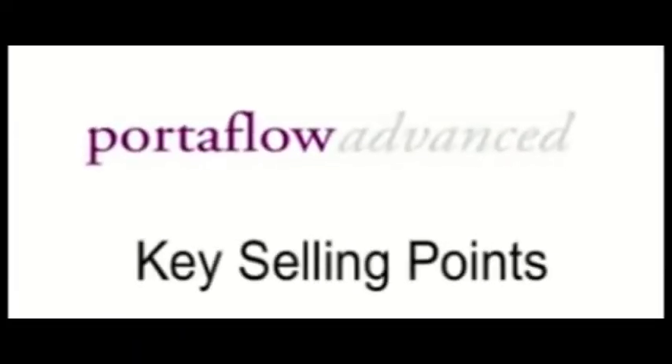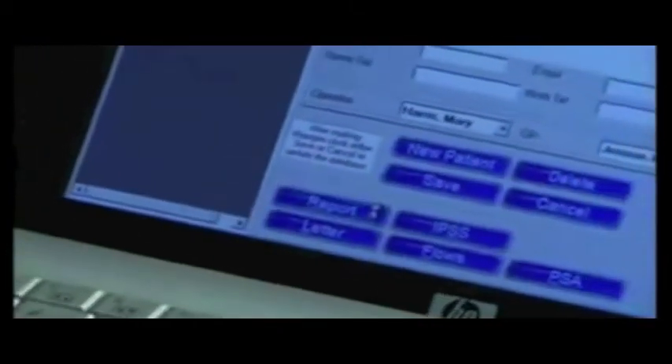Instead of the wireless weight cell flow meter, a wireless spinning disc flow meter may be used for recording. Key selling points for Portaflow Advanced include wireless connection to its flow meters — either a wireless spinning disc or weight cell flow meter — installation on any Windows-based PC, automatic input into standard reports and letters, link to PSA Watch and ultrasound devices from MediWatch, and the ability to export data into Windows applications.